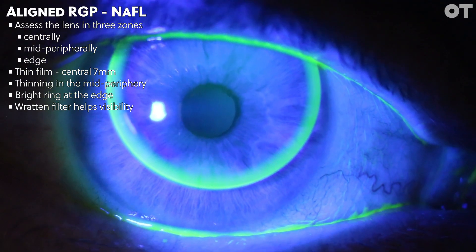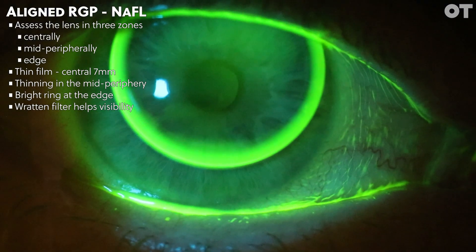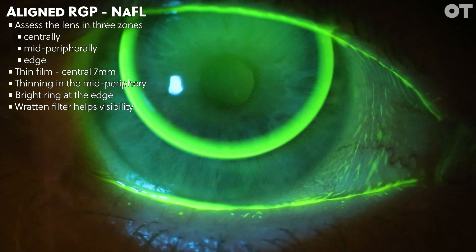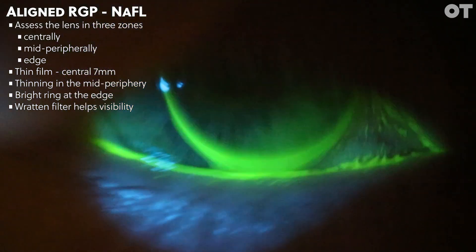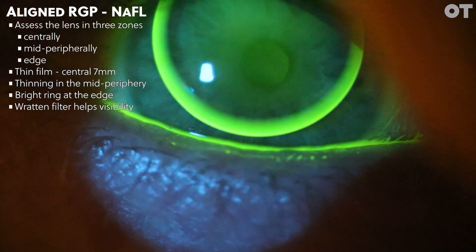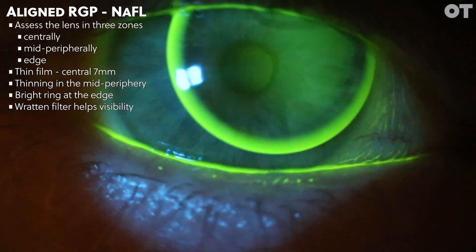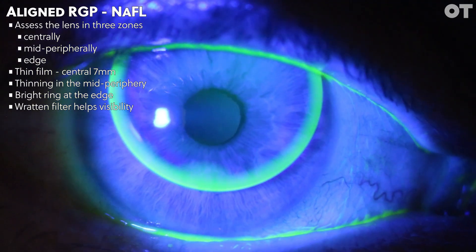Next, we should look at the fluorescein fitting pattern. It's good to divide the fit into three different zones, assessing the centre, the mid-periphery, and the edge. The central 7mm or so should exhibit a thin film of fluorescein, followed by a mid-peripheral area of light bearing, therefore thinning of the fluorescein pattern. The edge should show a bright ring of fluorescein where the lens lifts off the cornea, aiding in lens removal and tear exchange.